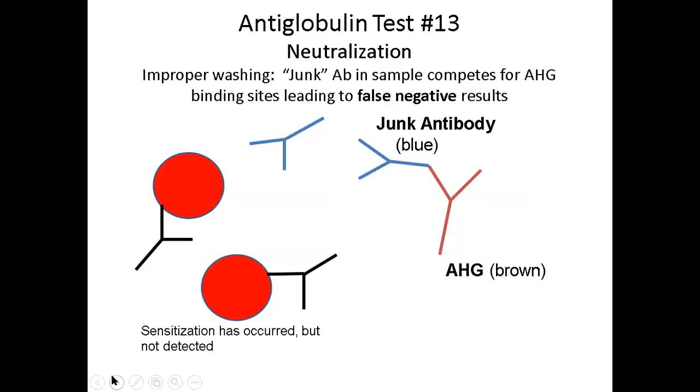So this is a very crude, basic slide because I am not a graphic designer and I made it. So you can have a little laugh at it, but hopefully it's going to clear up any confusion you may have about neutralization. Okay, so let's look at this picture. In our test tube, we have some red blood cells and they have IgG attached to them. Okay, so these are sensitized red cells.